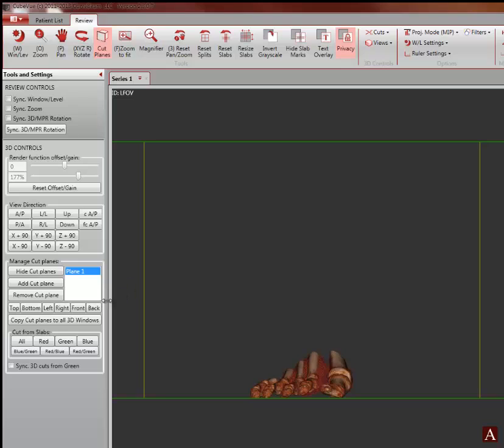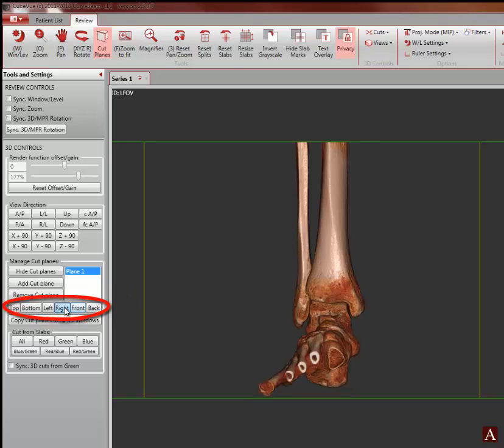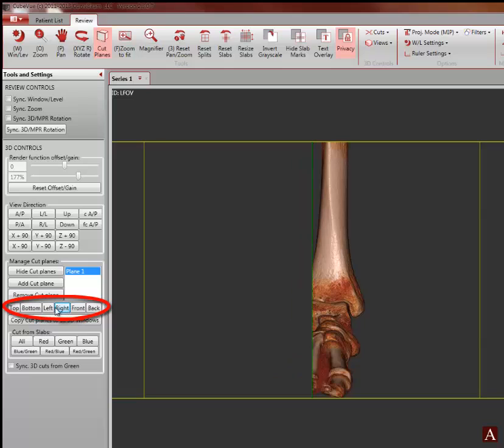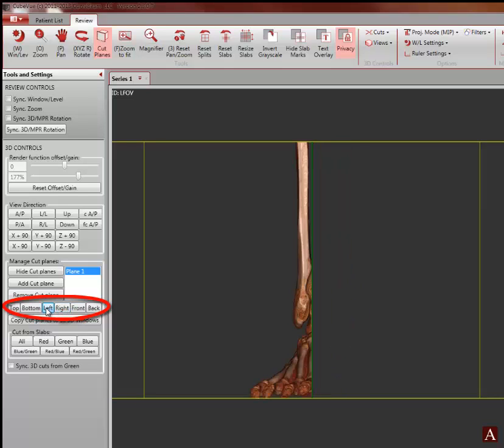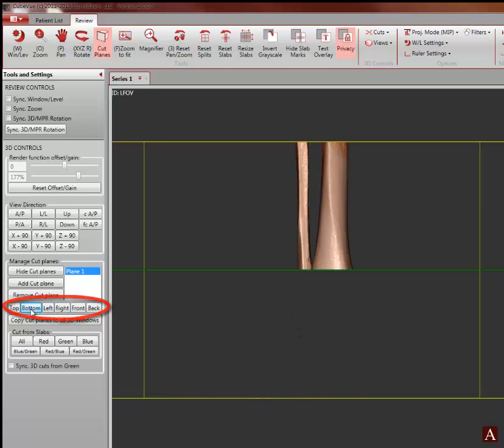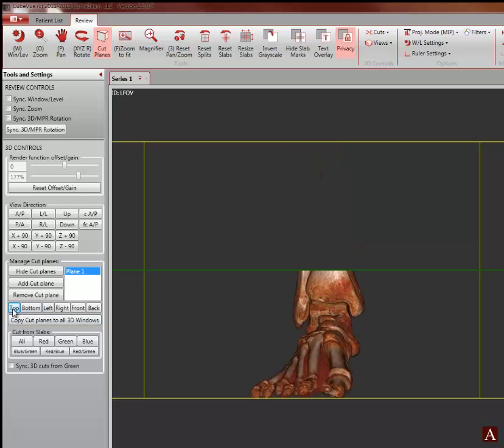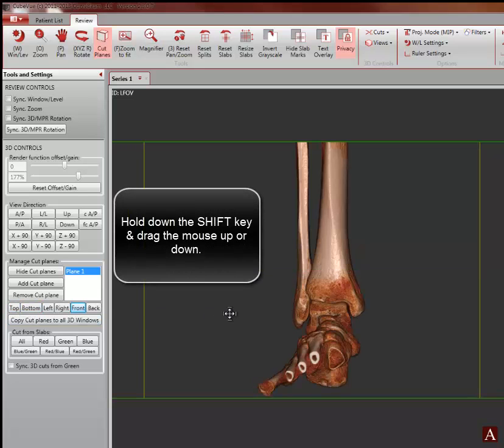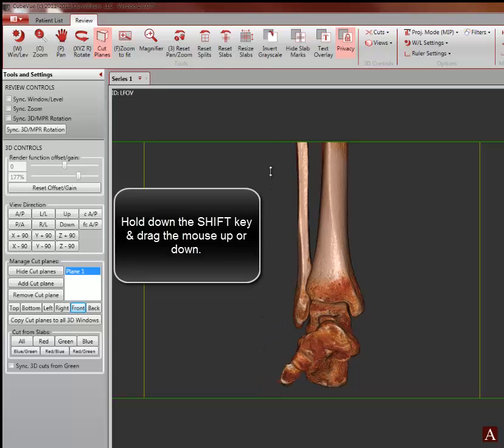However, the cut plane can now be inserted from any desired direction by clicking these buttons. For this sample, we will insert the cut plane from the front.